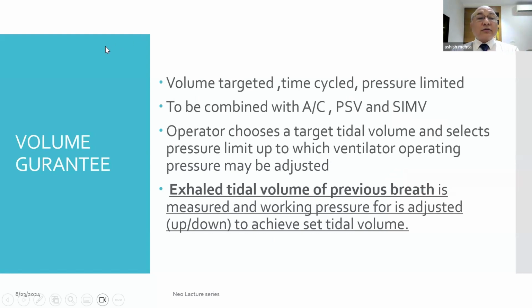So what is volume guarantee? This is a volume targeted, time cycled, pressure limited mode. TCPL, time cycled pressure limited ventilation, is the conventional term that we are using, and that was typical of any assist control, SIMV or PSV. Now, if we want to get the benefits of the volume control modes, then you put volume guarantee onto that.